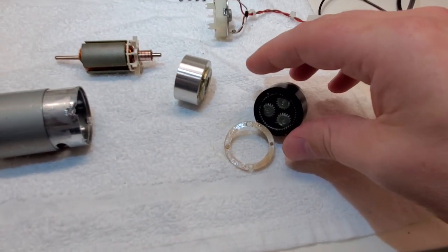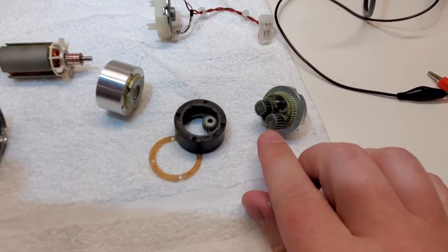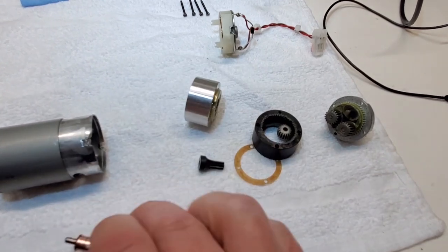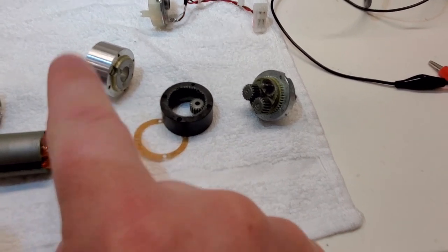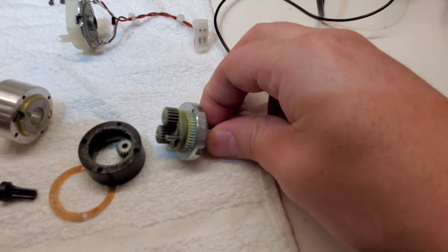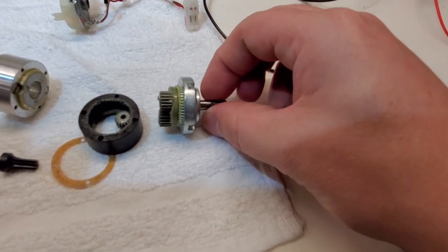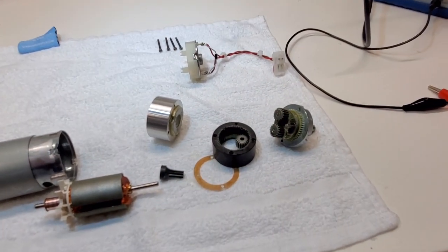So let's go over what we see right here. Let me pull this guy out. These guys right here are called planetary gears because they spin around, and this guy, which normally mounts on your output shaft right here, would be called the sun gear because it's in the center and the planets revolve around the sun. And you can see right here what happens is it spins these little gears, which in general rotates your output shaft. They're all attached by this large wheel. So that's a planetary gear reduction system.